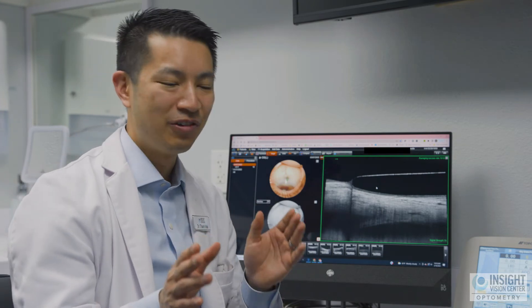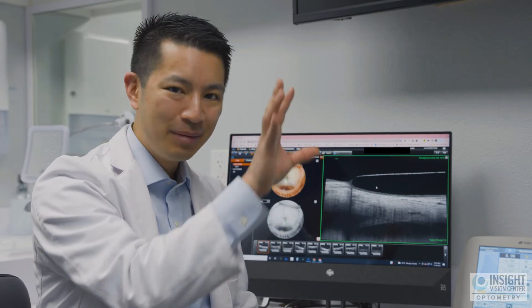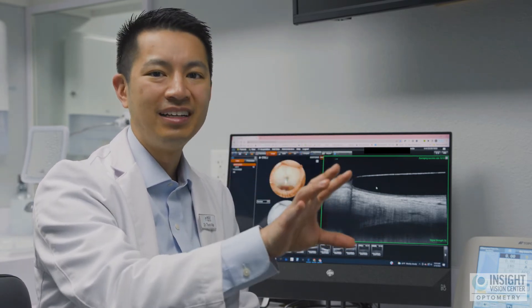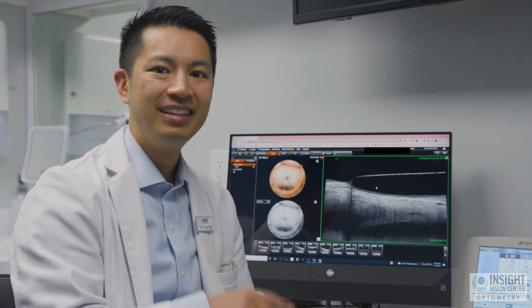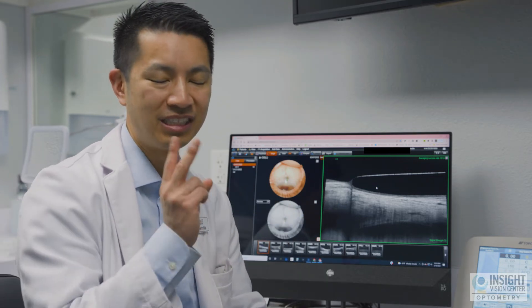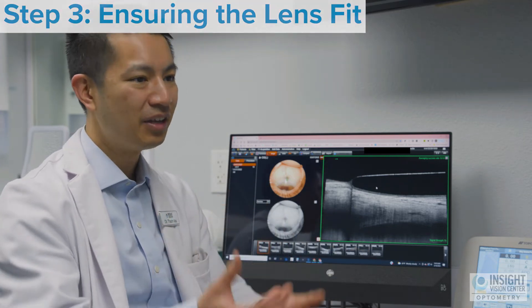Now we're on step three. Step one was taking an image of the shape of your eye with a scleral topographer — ours is the SMAP 3D — to determine what shape the lens should be. Step two was putting on a practice scleral lens from a trial fitting set to determine the right prescription through a phoropter. Step three: the lens has been ordered, it's arrived, and now you're wearing your custom-made lenses.